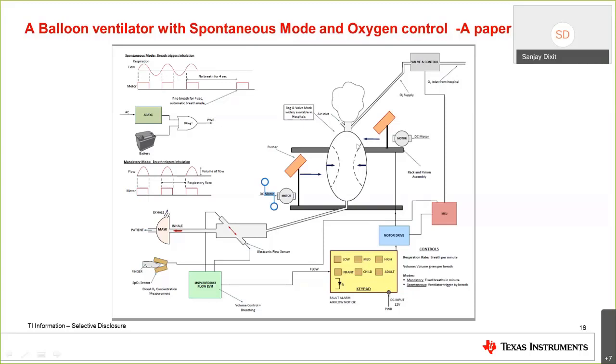Now this bag basically is just a one-way valve, and it takes an air inlet from the atmosphere. So when you press in, the air from the atmosphere is delivered into the patient, and the patient inhales the air. When he exhales, the air goes out through a hole in the mask, and the bag itself again draws in air from the atmosphere and opens out again. So this way they can give artificial ventilation.